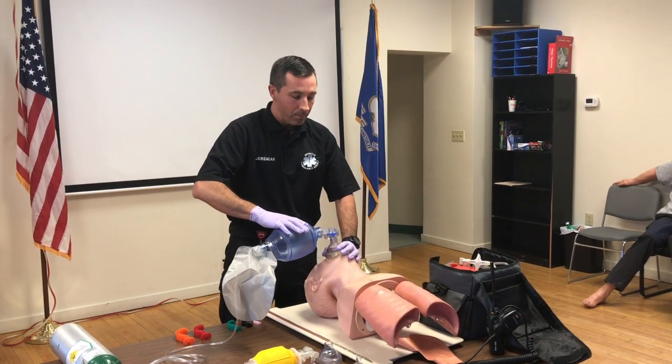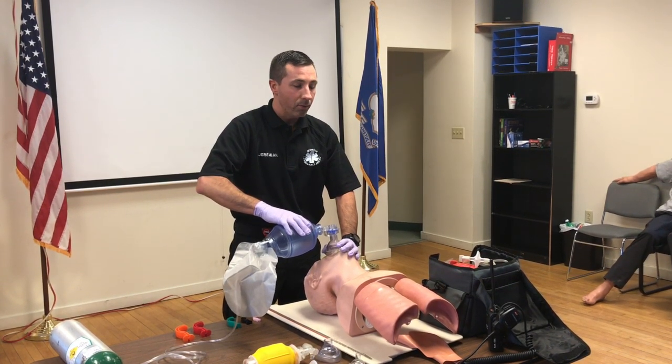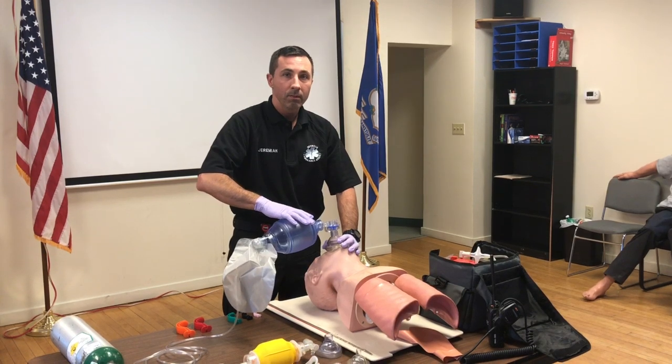How would you know if you were delivering appropriate volumes with each ventilation? I would look for equal and bilateral rise and fall of the patient's chest. I'm done with this station.